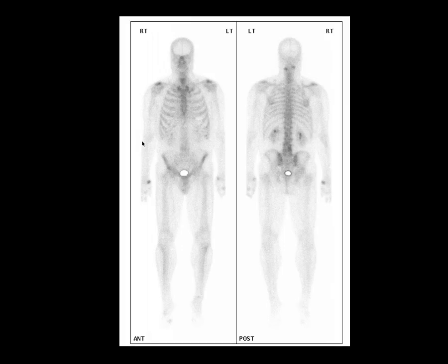In this picture we're going to look at two important findings. First is cervical spine facet degenerative change, which is very commonly seen and we have to recognise it so we can discount it as not significant. Here's a classic example: these rather linear horizontal foci of activity to the left and right of the midline, well away from the centre — the classic appearance of cervical facet degenerative change.